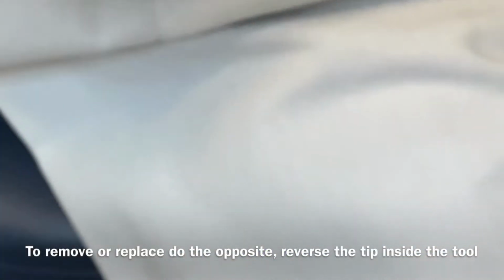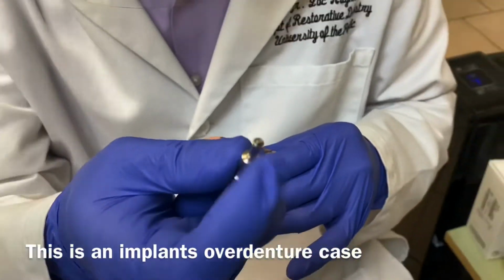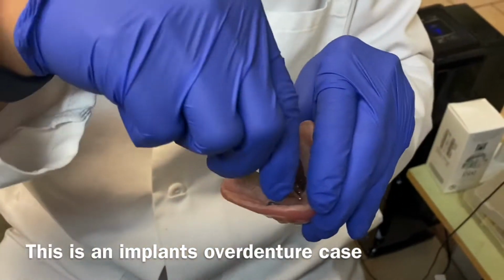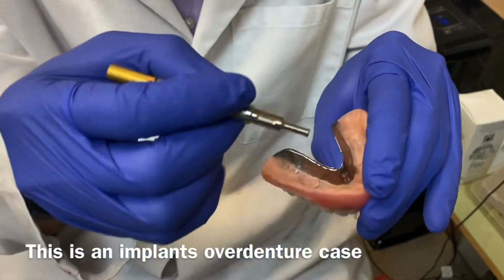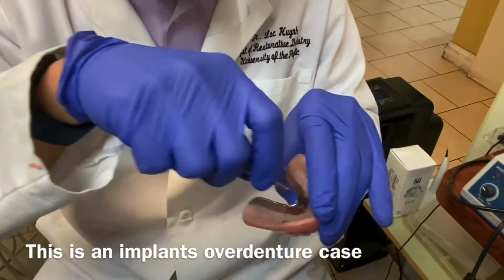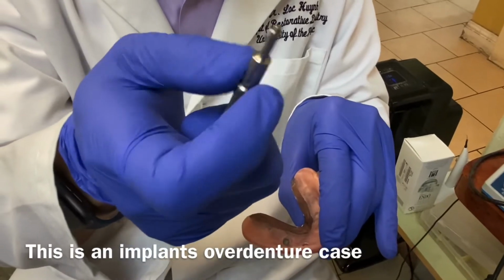Now I get smarter. Now I understand this device here. You have to move this sticking out like this, and then you push it in. It's okay. But if you do this and you put it in here, you will take out the things. This device is tricky. To take out this thing, you would do this, but to push the little rubber in there, you have to move this out. This one right here, move out.